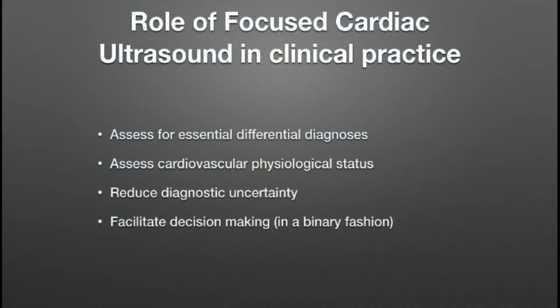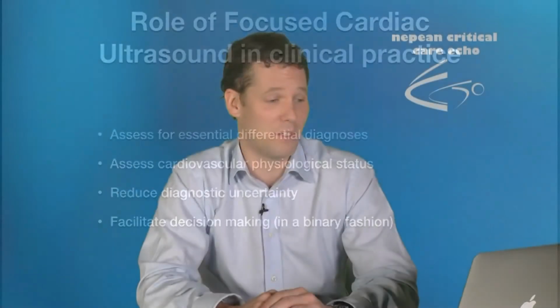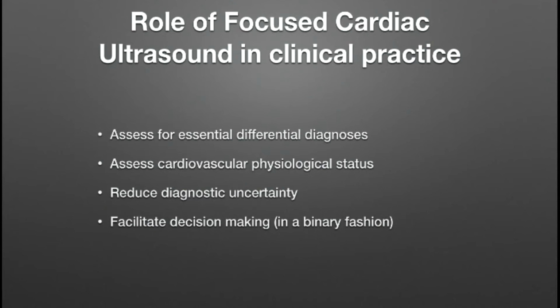The role of focused cardiac ultrasound in clinical practice is a powerful one. This examination can be used for making essential diagnoses such as tamponade, diagnosing significant left ventricular or right ventricular dysfunction. It can also help in assessing certain cardiovascular physiological statuses, such as significant hypovolemia, for instance. It can reduce diagnostic uncertainty, but it's not perfect.